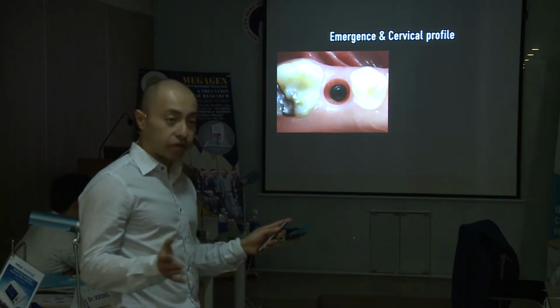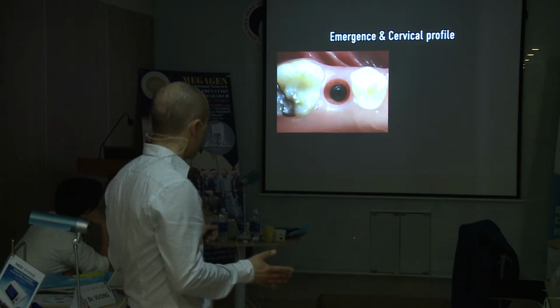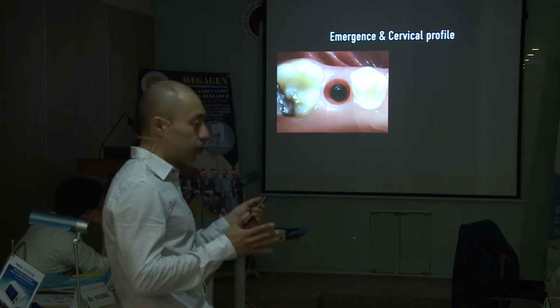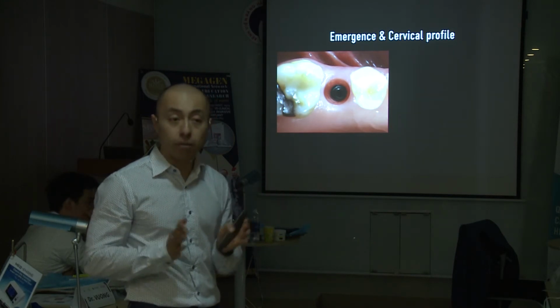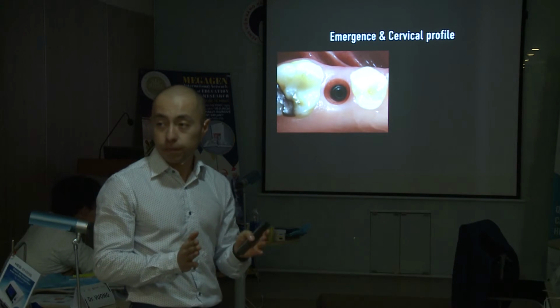Then if you have enough soft tissue, you have to think about how the tooth emerges. Emerge is another word for comes out of the soft tissue.